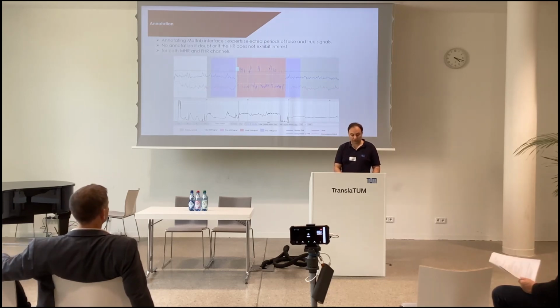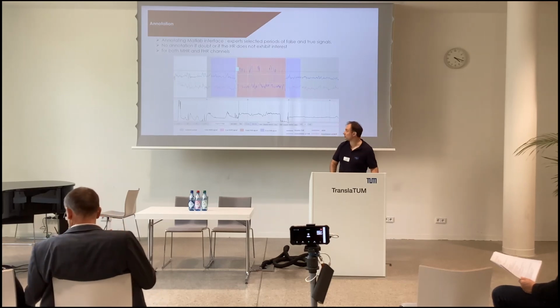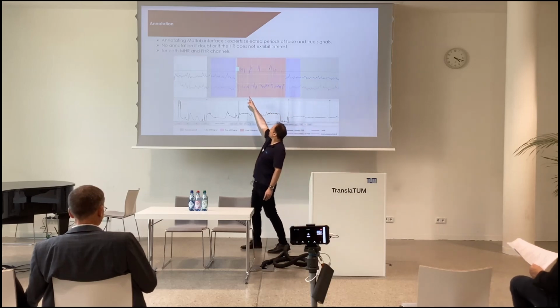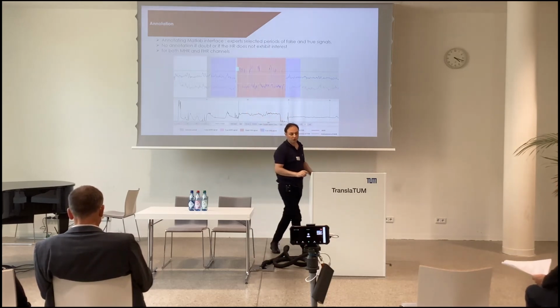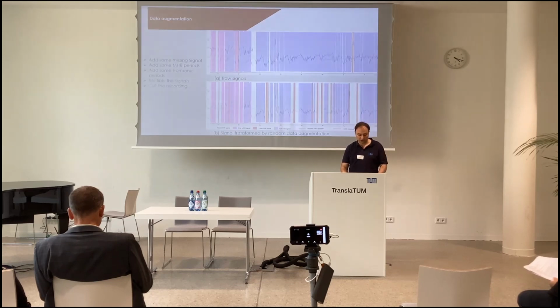We can annotate both the fetal heart rate and the maternal heart rate channels. For example, there are small samples of false maternal heart rate, which is less common, but if you don't detect that, you may make some errors afterwards for the fetal heart rate.